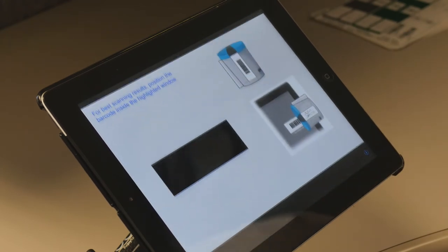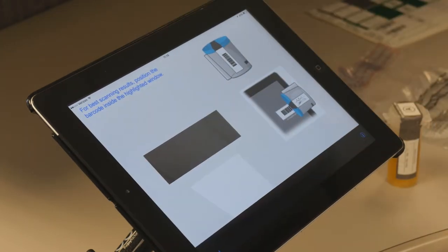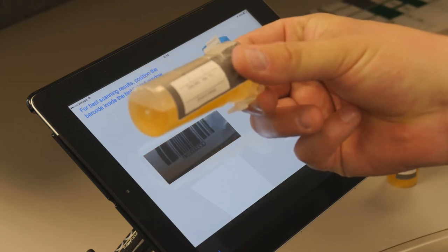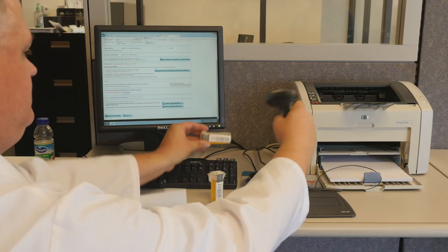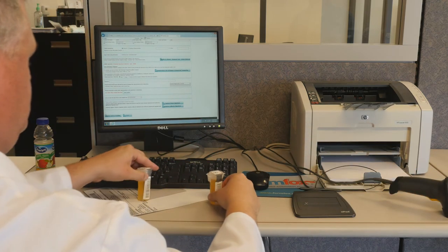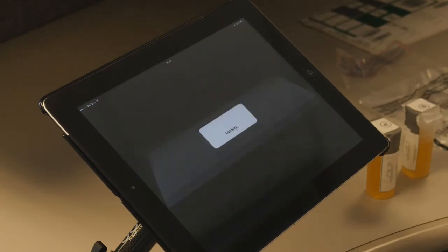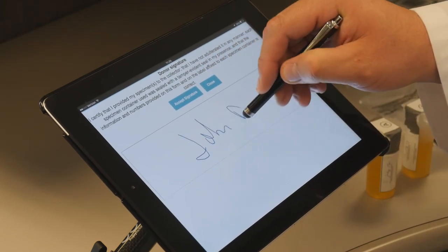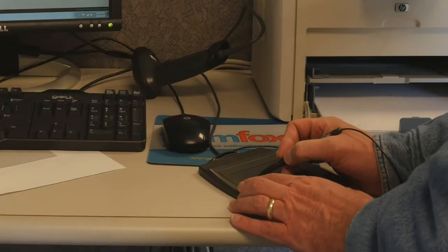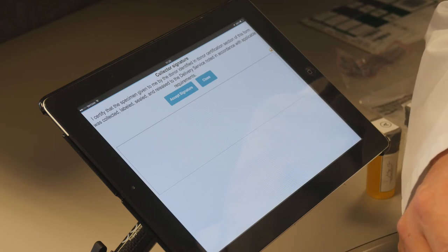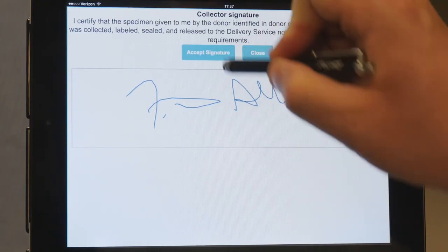This is done by tapping the scan barcode box. The tablet camera facing forward will become active. Position the barcode of the label attached on the container into the highlighted window until it comes into focus. If you are using an external barcode scanning gun, you will need to point and shoot to capture this barcode. Re-enter the sample seal specimen ID in the verify step if entering manually. Then tap the sign affidavits box. The donor can sign the tablet directly with his or her finger or a stylus, or if using a signature pad, use a stylus that comes with this external device and then select accept signature. Otherwise, if a tablet or signature pad is not being used, the donor can sign with a regular pen after printing the final CCF. Then the collector signs and taps accept signature.